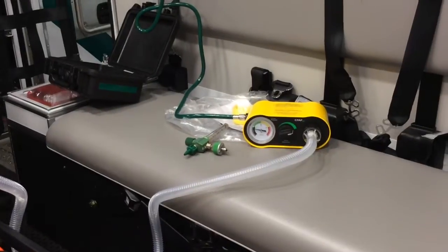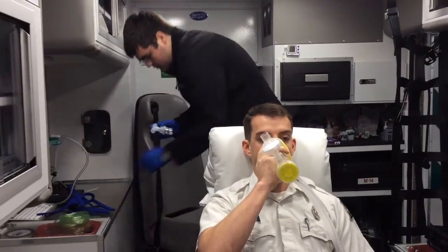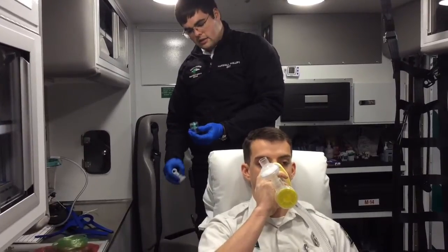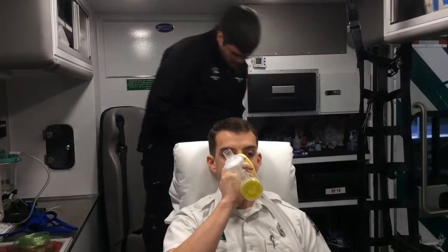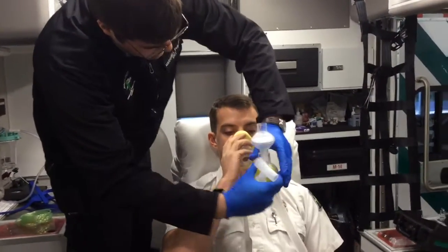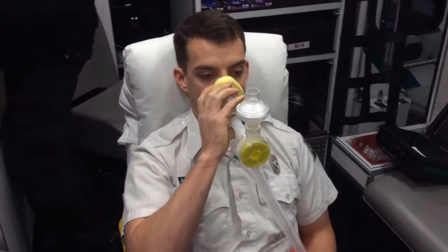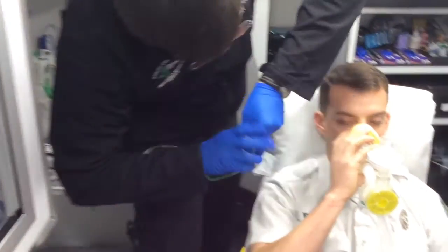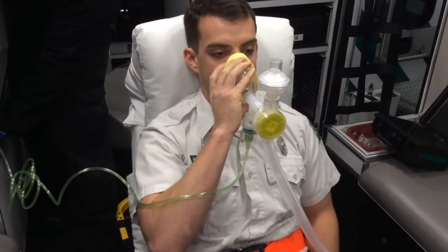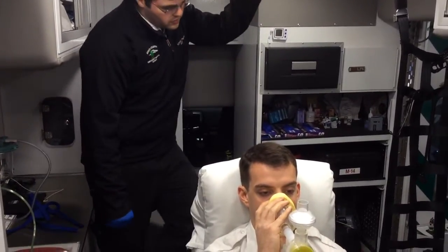At this point, we see if our medic wants a med neb. The med neb is located up here and would generally be in its own packaging. The way you set up a med neb is to unscrew it, apply your medication — which is typically Atrovent and Albuterol; they come in these packages. A small plastic tab breaks open and you pour it inside, then screw the top back on. This fits in line between the mask and the device. We then apply air to the med neb itself using 8 liters per minute. We always apply the air to the med neb last, once it is closed, in order to avoid blowing the drug all over the place.